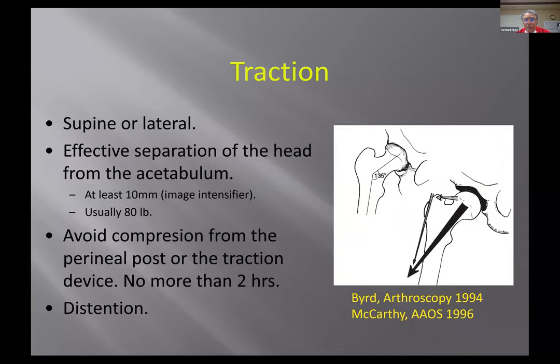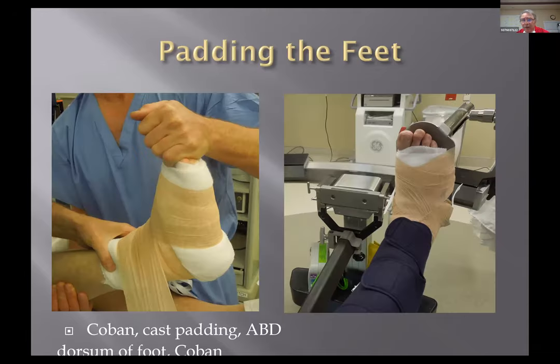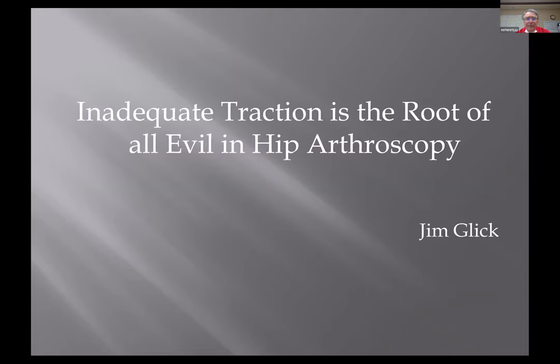Again, traction is the key to surgery. It lets you open the joint and get views that you need. A little bit of flexion also relaxes the capsule. So if you look at this, you're getting slight abduction and a little bit of flexion. Some people use a little Trendelenburg also. We pad the feet. We pad this ipsilateral arm to get it out of the way. And if you don't get enough traction, you're not going to get in the joint. You're going to scratch everything getting in there. You're going to ruin your instruments and your patient's hip.